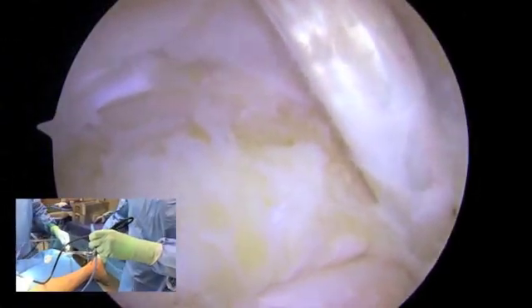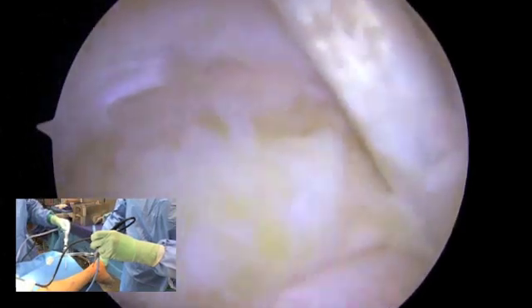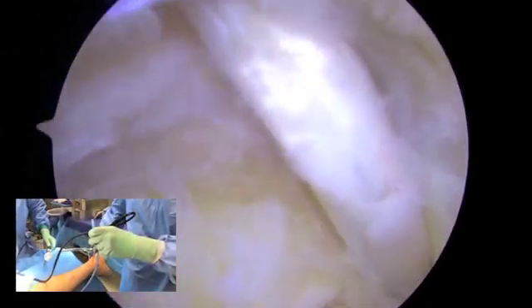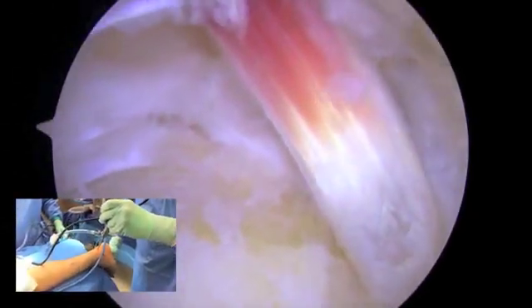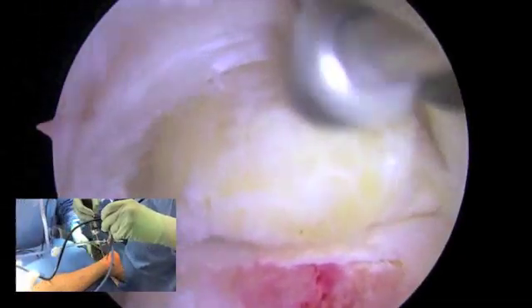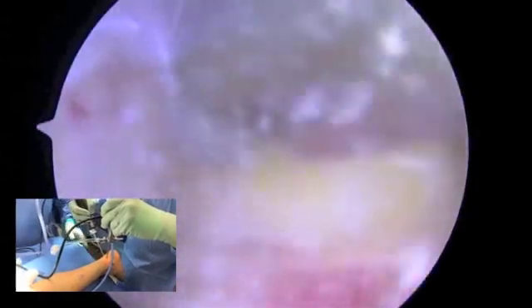Here I've identified the flexor hallucis longus. If there's any question as you're entering the joint, you can do range of motion of the FHL simply to make sure that you're seeing what you're seeing appropriately. This helps to protect the FHL tendon, and so I think the hood is important.